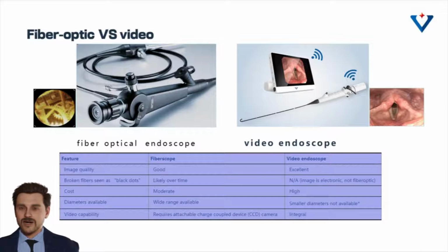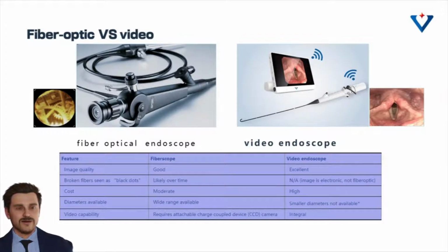Fiber optics consist of a bundle of flexible glass fibers able to coherently transmit an image. There were physical limits to the image quality of a fiberscope. A bundle of, say, 50,000 fibers gives effectively only a 50,000 pixel image, and continued flexing from use breaks fibers and so progressively loses pixels. Eventually so many are lost that the whole bundle must be replaced, at considerable expense.